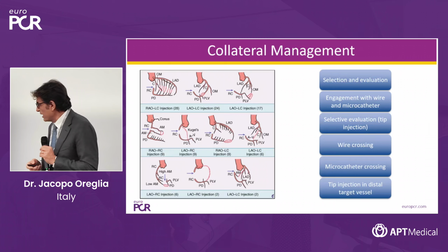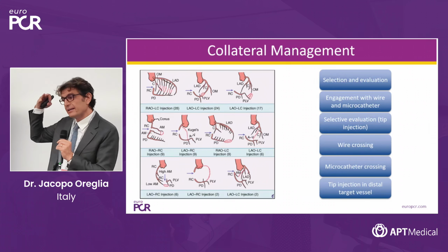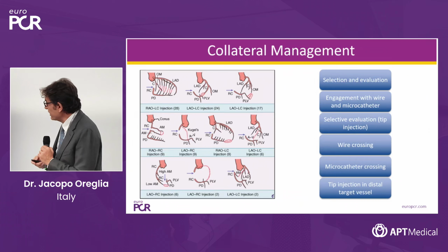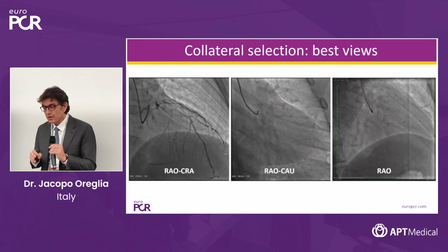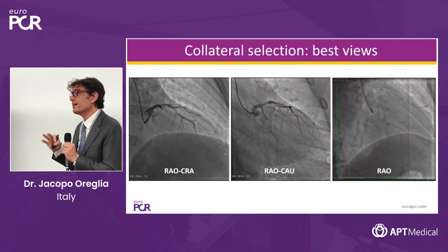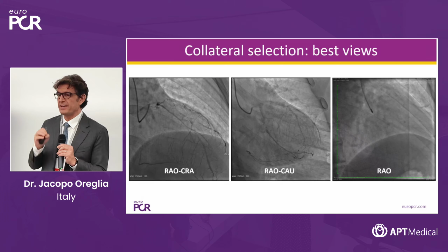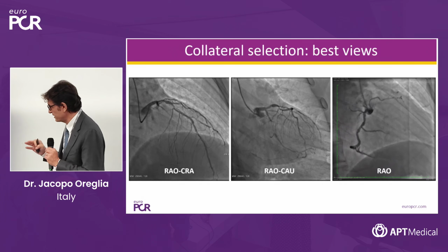So I will go through these steps, which are the steps that I usually use in my mind to cross an epicardial, and to cross a septal, sorry. And the first one is to understand which one I want to cross. So Dr. Tang already explained that it's very important to review the basal angiogram a lot. You have to spend a lot of time on the basal angiogram.